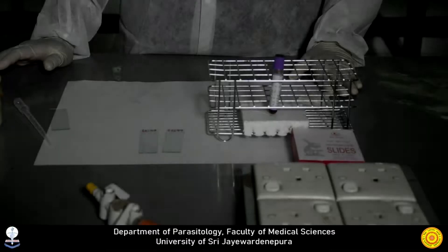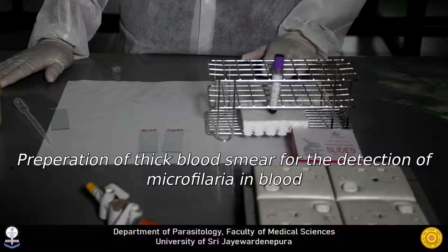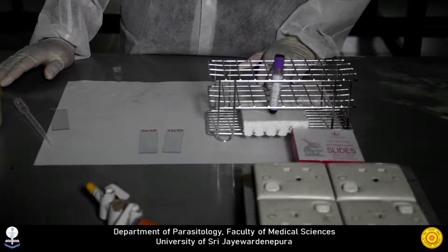We are going to demonstrate preparation and staining of a thick smear for the detection of microfilariae in blood. For blood microfilariae, capillary or finger prick blood is preferred because microfilariae concentrate in the peripheral capillaries.